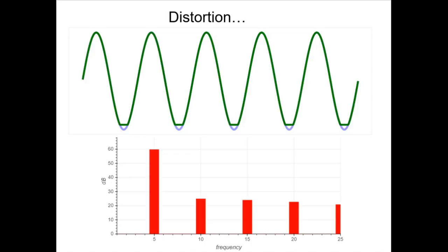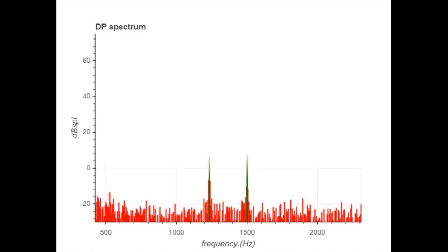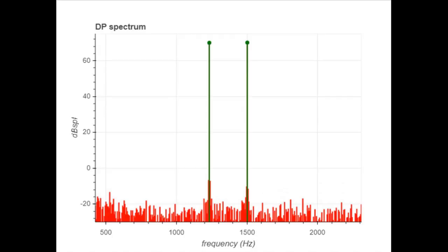And we can use the same thing to measure the distortion in the amplification process inside the cochlea, because when you add energy, invariably there's a small amount of imperfection in the system, and that amplification process introduces some distortion. And so if we look at this in the context of a distortion product measurement in the cochlea, so again we're going to have frequency on the horizontal axis, energy or amplitude on the vertical axis, and this is a measurement from my ear using two tones, fairly closely spaced, and we refer to those as F1 and F2.